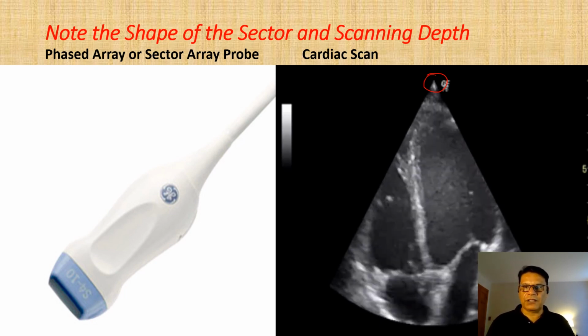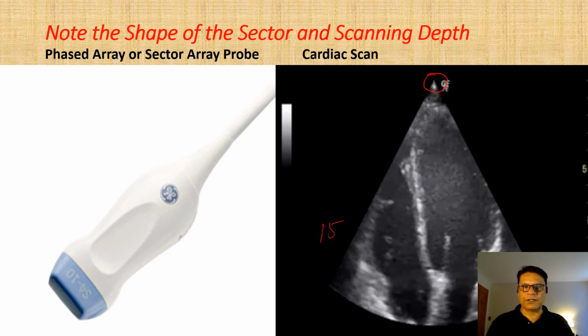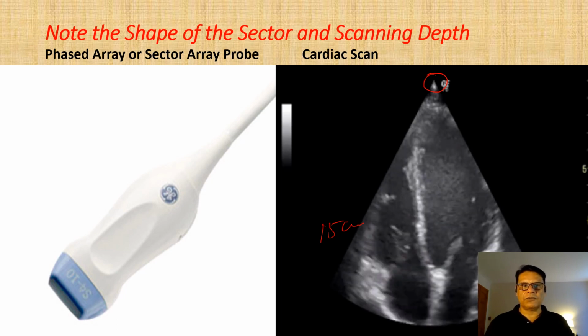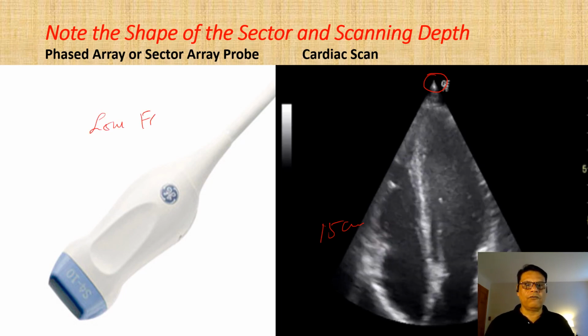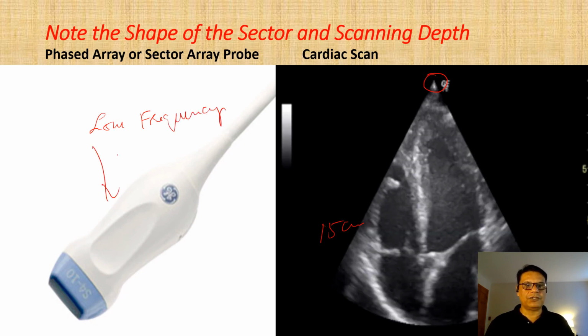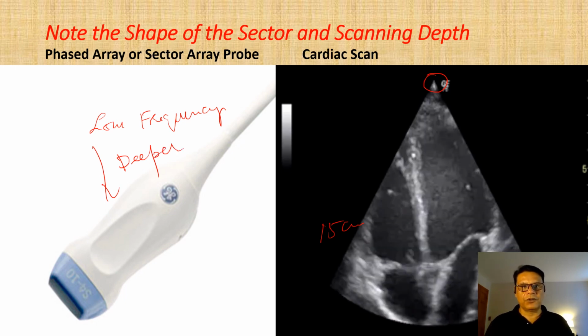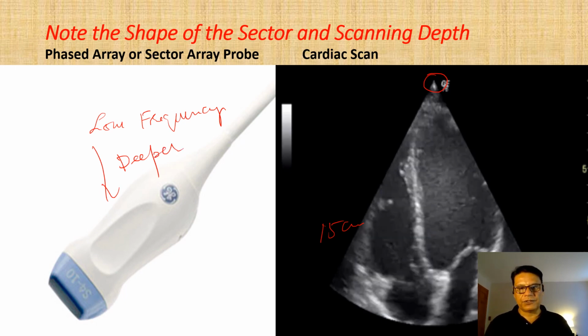And if you see the depth, it is almost scanning at 15 centimeter, and it is only because it has low frequency, and low frequency probes have the ability to see deeper, but resolution is not as good as the linear probes have.